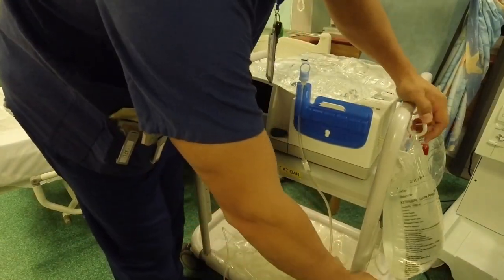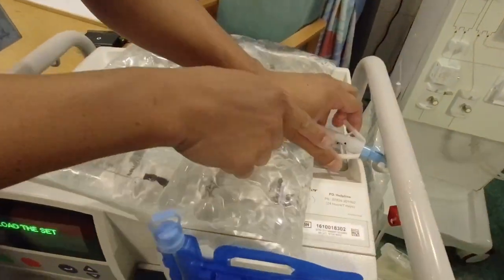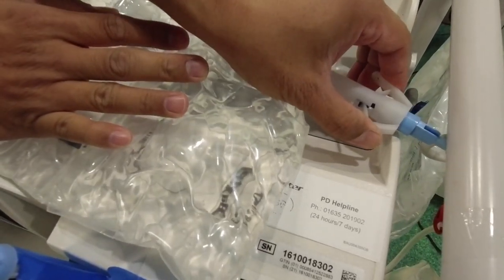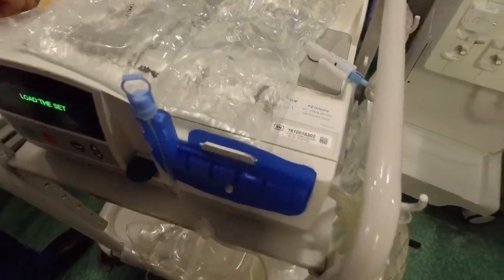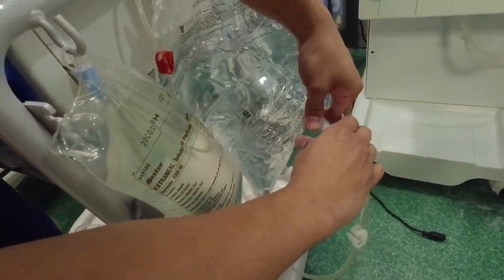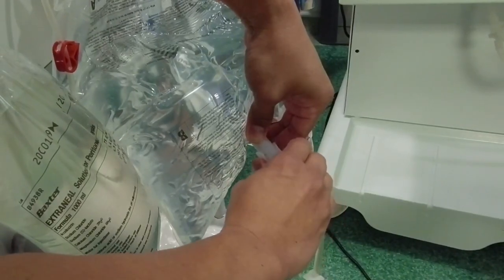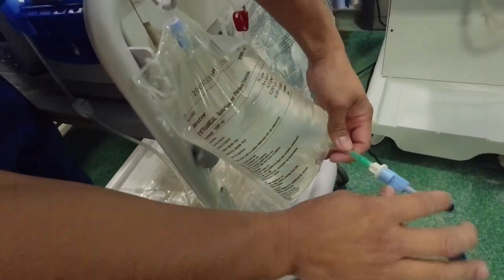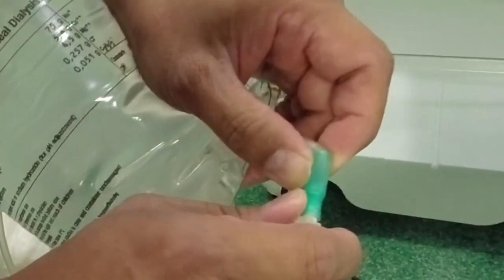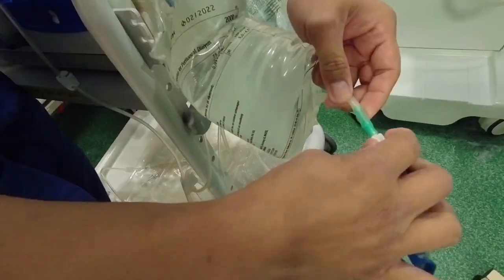and we can open the seals now. Okay. Right, so those are the seals. So first one, just press that together until you hear a click. And then same with the other one. Okay, press both on the side until you hear a click. Secure that in place. It means the seal is broken. For the last one, it's a green seal in there. Just break that left and right. You see it's broken, so that's open.